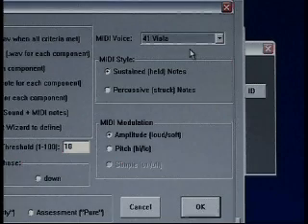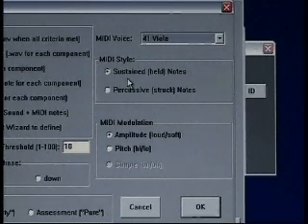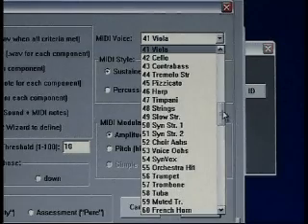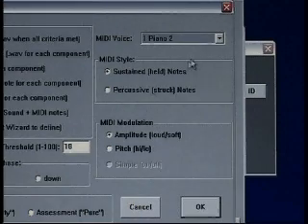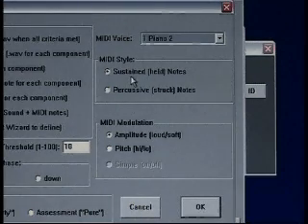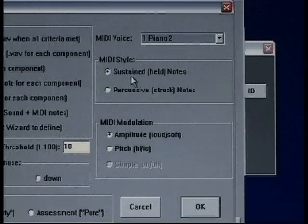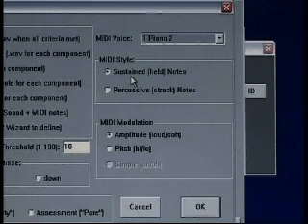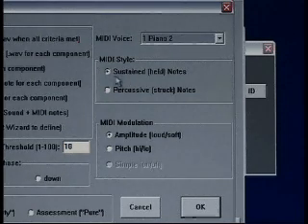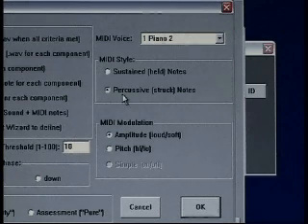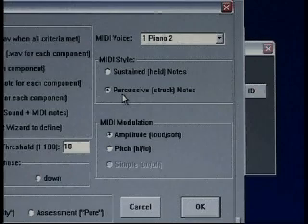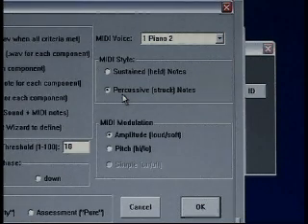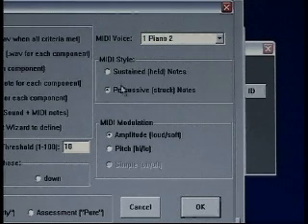Our next decision is the MIDI style. To make it simpler, let's choose piano. If you're looking at an instrument such as a piano and trying to define its style, think of it as: when you strike a key, does it play and fade or does it continue to play? Is it sustained or percussive? Piano tends to be percussive. A church organ, for instance, would be sustained — as you press the key down, the note continues to play until your finger comes off. A piano plays and then fades away. So we'll choose piano and select percussive.